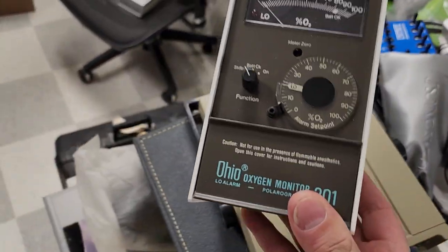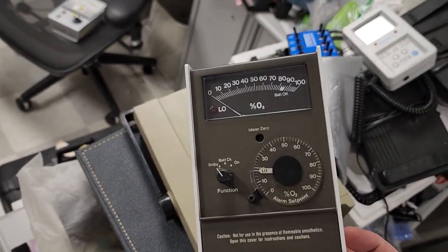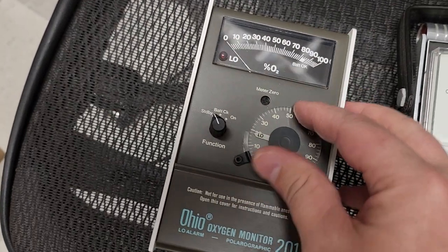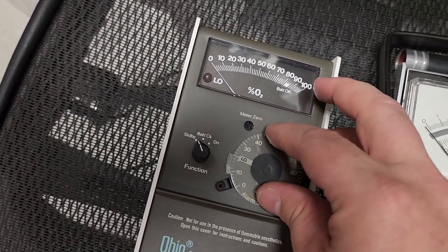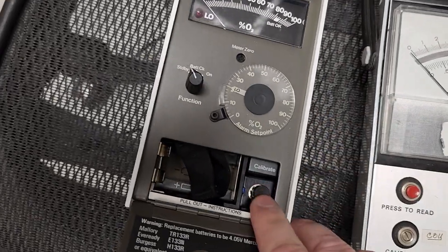Take a look at this — oxygen monitor 201 by Ohio Medical. Yes, it is analog. You've got your range right here that you can set. Look at that — you can adjust your low, your high, and you can zero the meter. Gotta love all the electronics.